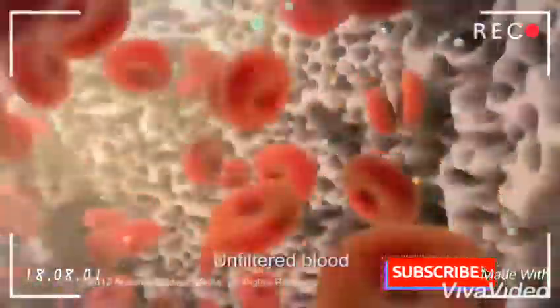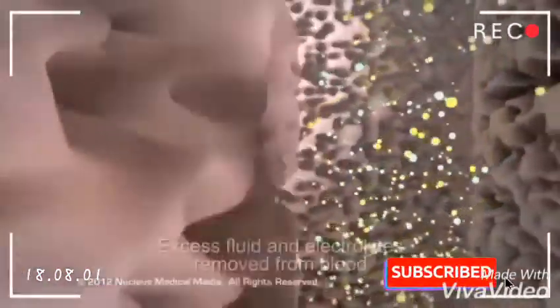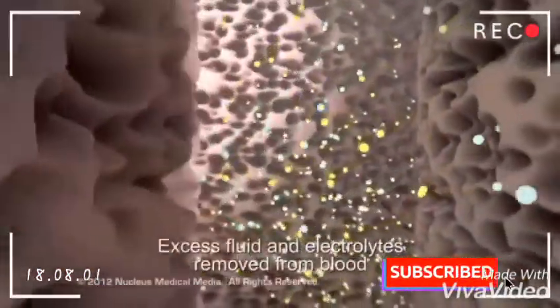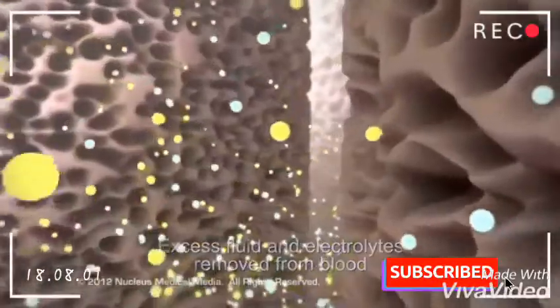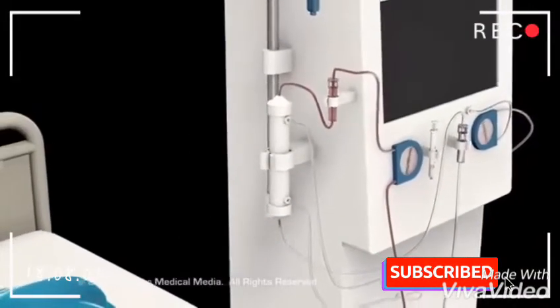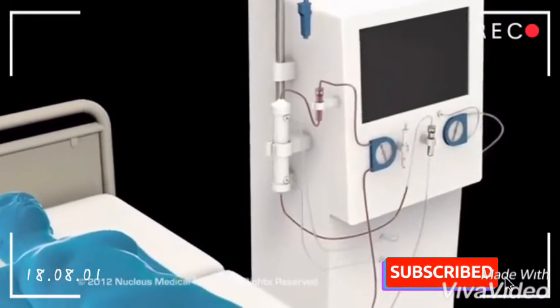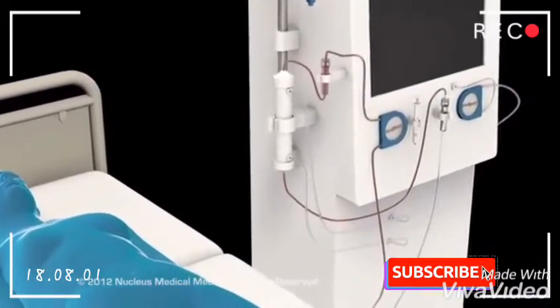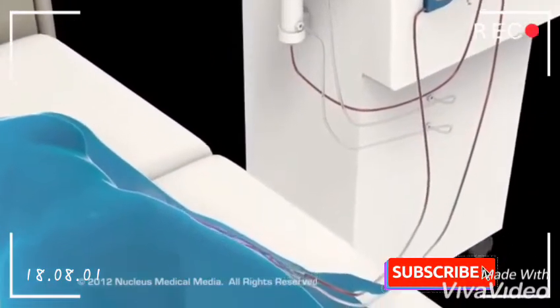The fibers will remove waste and excess fluids and electrolytes from the blood. The clean blood will emerge from the dialyzer and continue through the tubing, back into the body through the second needle at the access site.